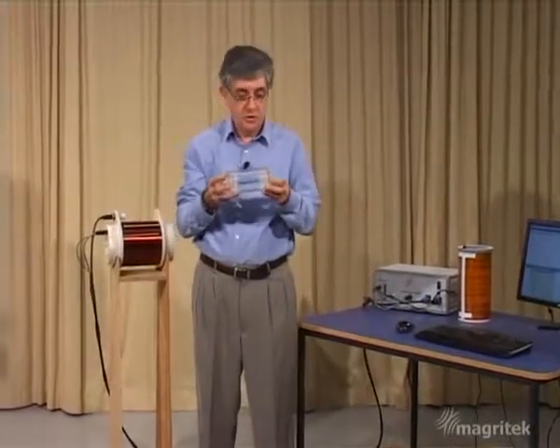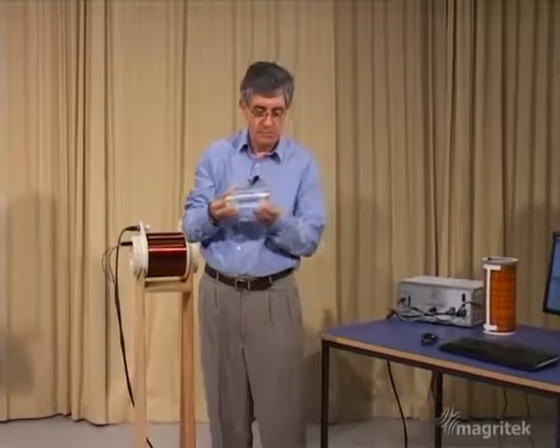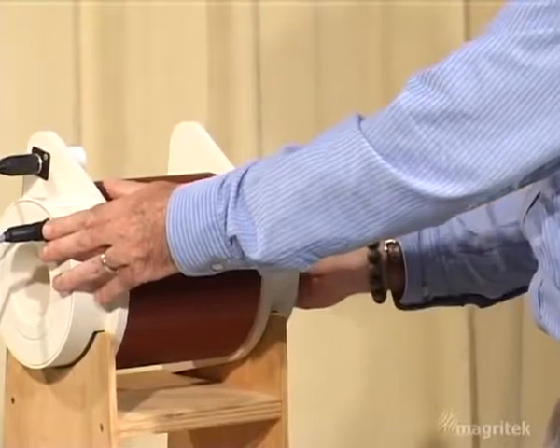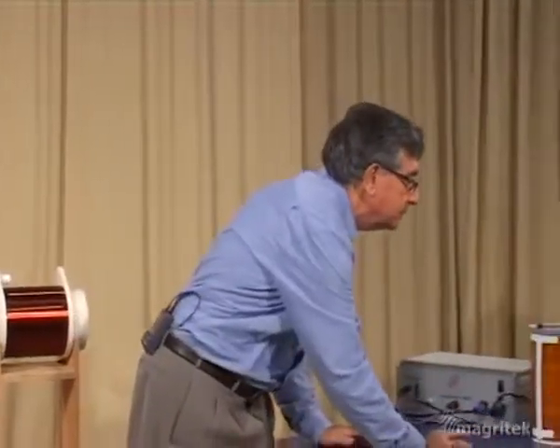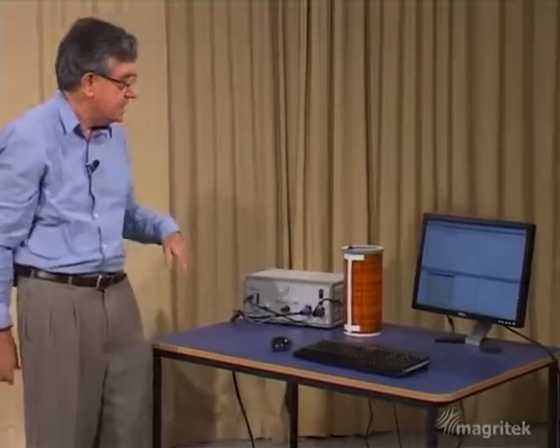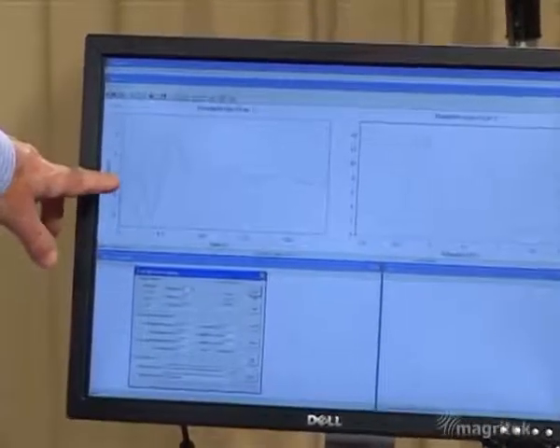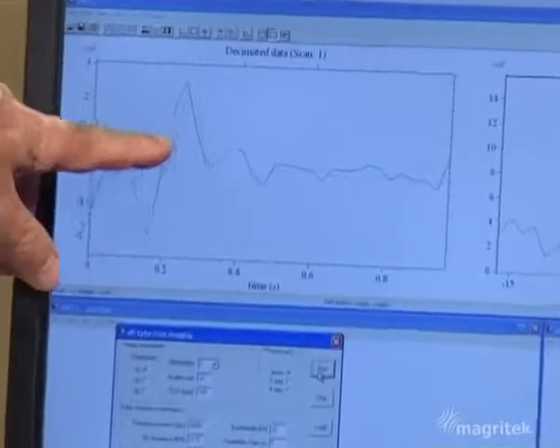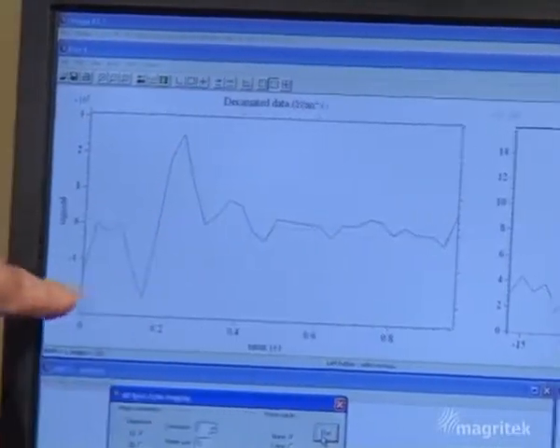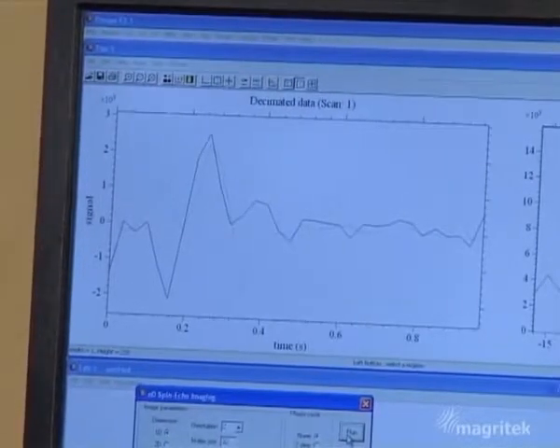First, I need to put the two tubes of water into the probe. And now I'll run the experiment. Prepolarizing pulse, and then the spin echo sequence under the influence of the gradient. And here we see the nuclear spins coming into phase, the centre of the echo, then going out of phase across in this time domain representation of the signal.